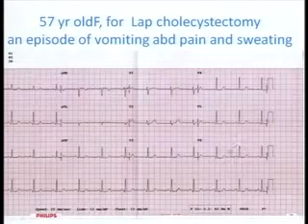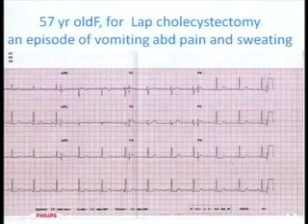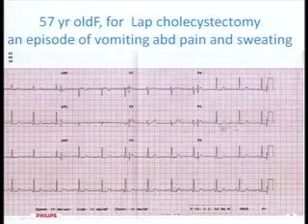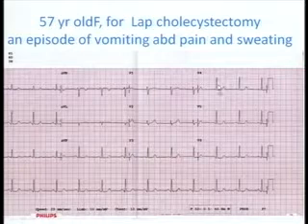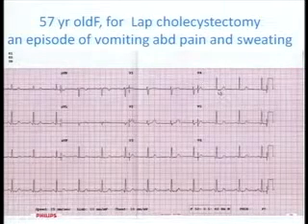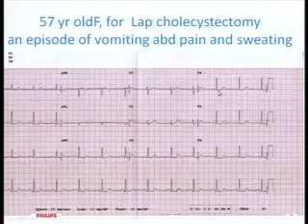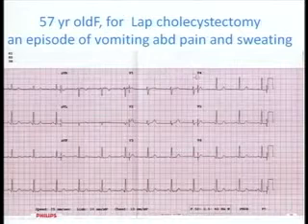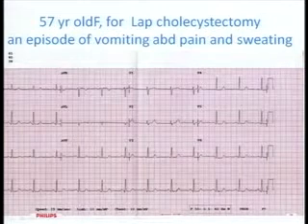Exactly. Someone said it right. Horizontality of the ST segment. When you have a horizontality of the ST segment, when there is a sharp takeoff, you see this. Colin Shamroth used to call this, it hugs the baseline. It hugs the baseline and there is an abrupt takeoff. This is one of the earliest signs of an ischemia.